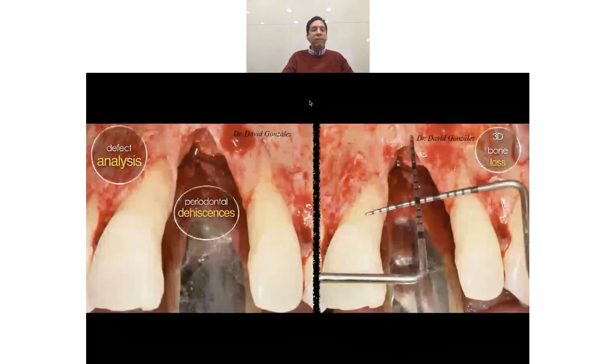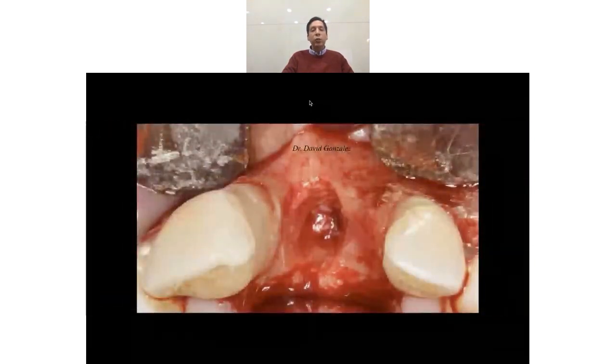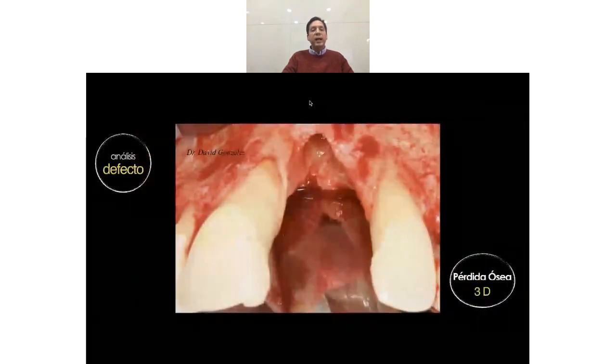So in my opinion, it's a very, very tough case, not only because of the bone defect, because of the lack of palatal wall, but also because of the periodontal dehiscences. This is the communication with the incisor canal, and this is the lack of the buccal bone wall.